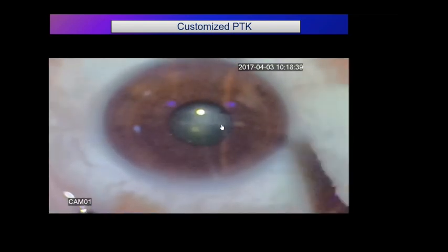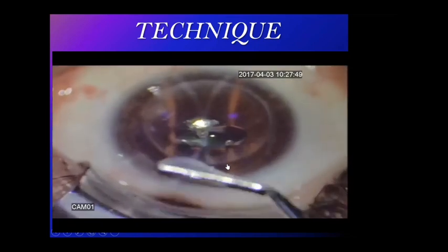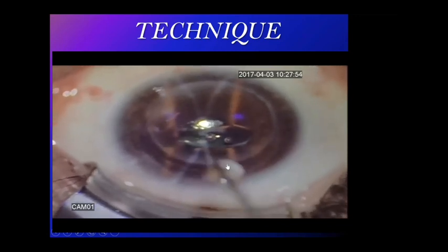And this is also another one. Now look here. You see that it is here. The breakup is down here, which means really at 12 o'clock because the patient is flat. Look at it. This is a corneal graft with scarring at the edge of the graft. Again, you can see that it was irregular. And then you have to put a drop of the thick solution, and then you distribute it.